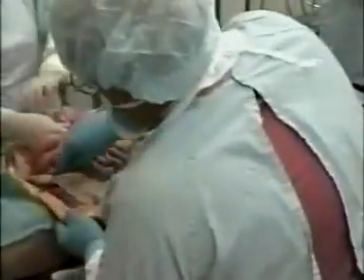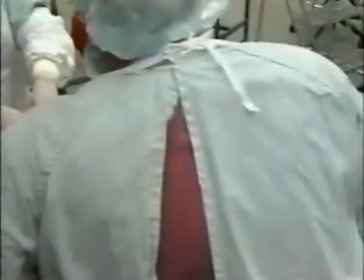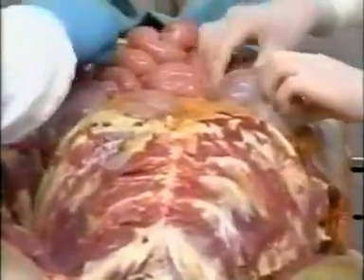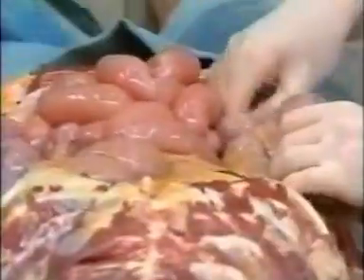The doctor's examining the loops of bowel, trying to find the appendix, and she's found it, and so she'll remove that. We keep that basically as a way of helping us identify people. If they have their appendix in place, it's an identifying feature.